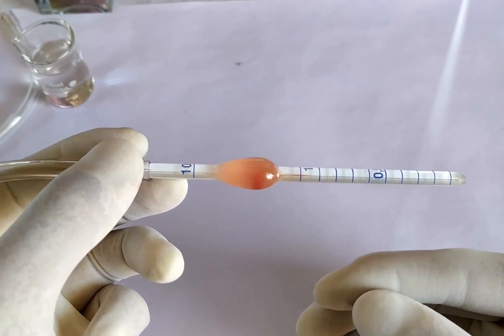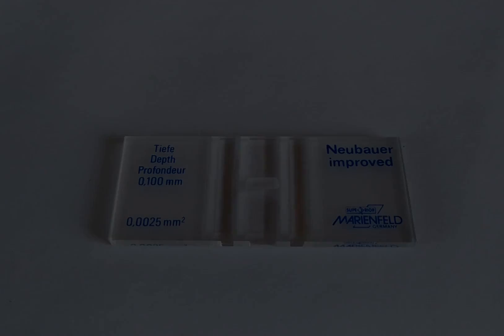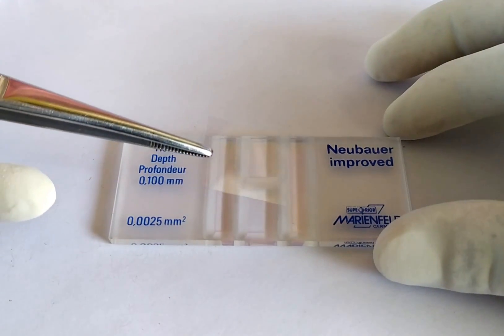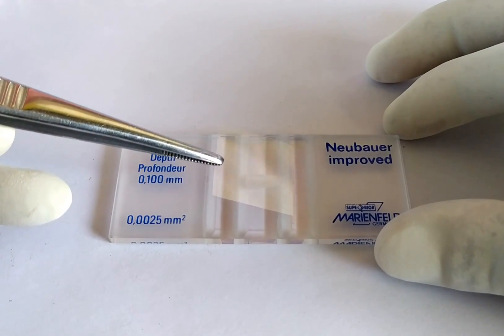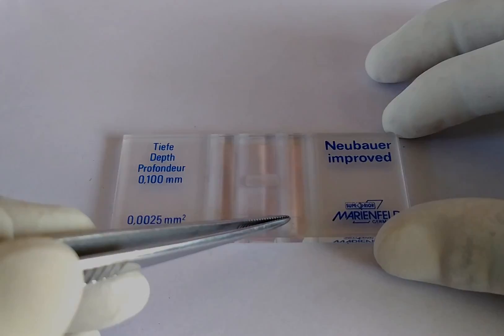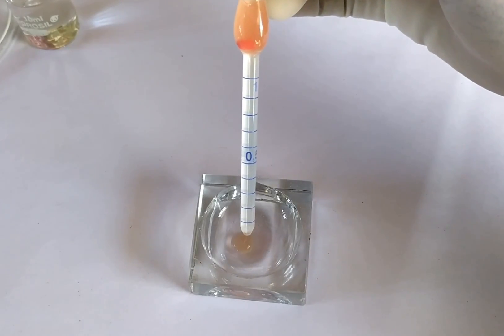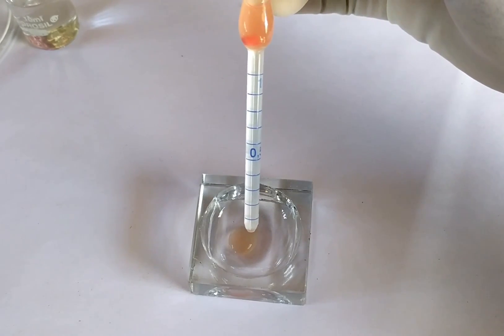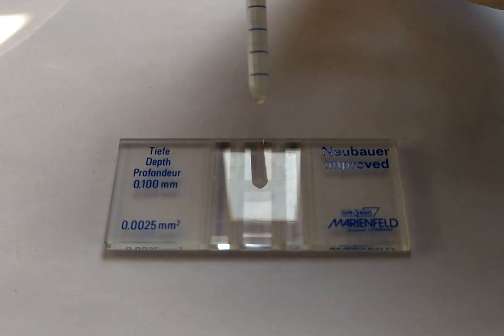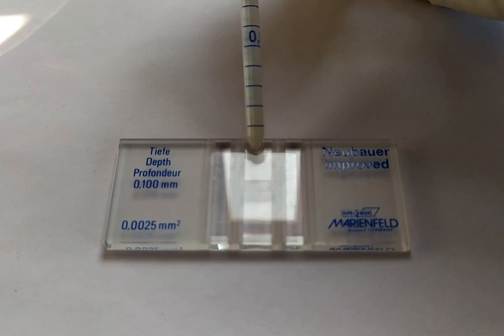Once this is done, prepare the counting chamber for sample loading. Take the counting chamber and the cover slip, both pre-cleaned with alcohol. Carefully position the cover glass on top of the support platforms located on both sides of the counting chamber. Discard the first few drops from the RBC pipette, then carefully position the tip of the pipette on one edge of the cover glass. Allow the contents of the pipette to gradually flow into the narrow space between the cover glass and the counting chamber via capillary force.